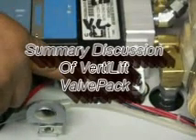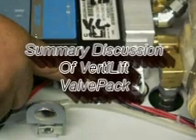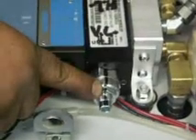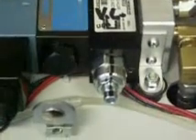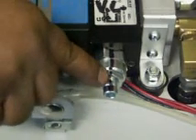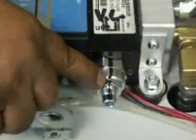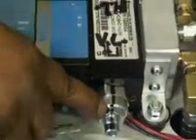At the factory, once the valve pack is set, both on the VertiLift side, left side of the table, and the Hylo side, right side of the table, a mark is put across the valve, jam nut, and adjusting screw to establish the factory setting. That setting should not need to be altered under normal conditions.